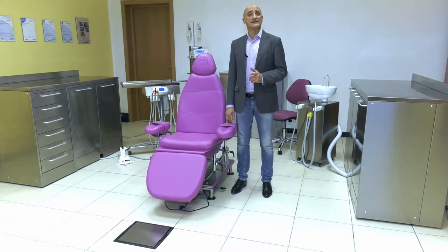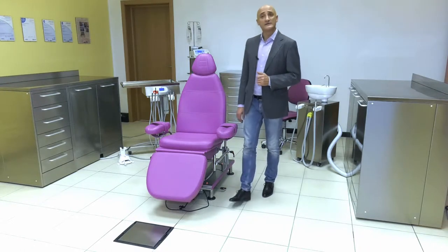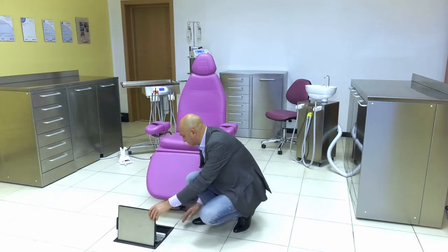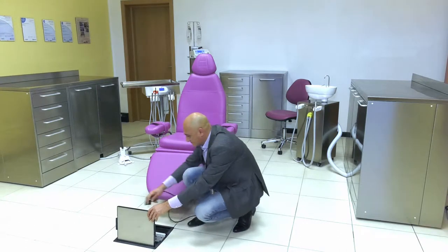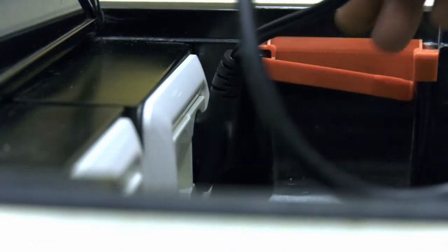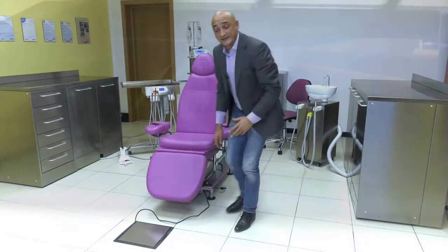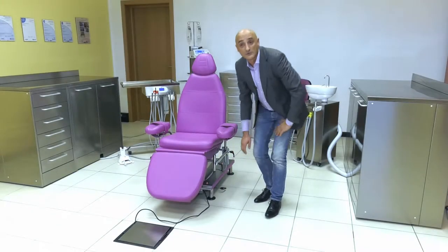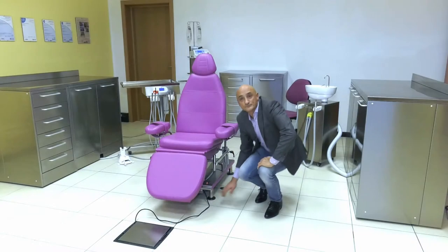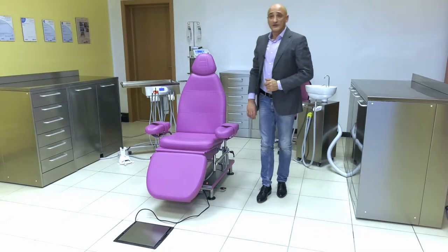Firstly, I am proud to say that it has been designed and made entirely in Italy by our staff. I will now plug it in. Once this is done, I only need to switch on the chair by pressing this button.